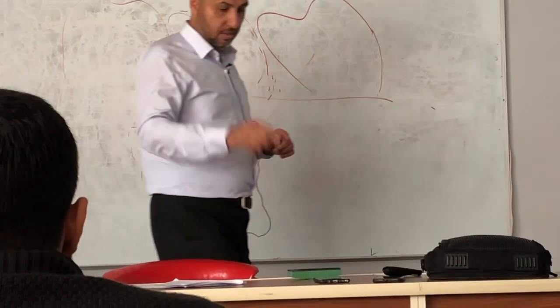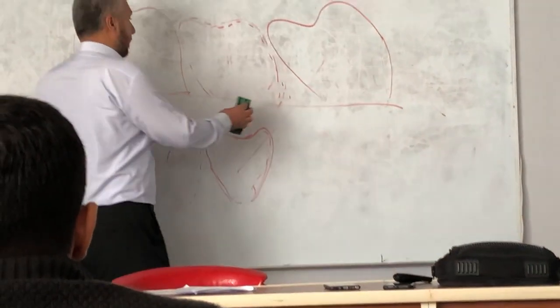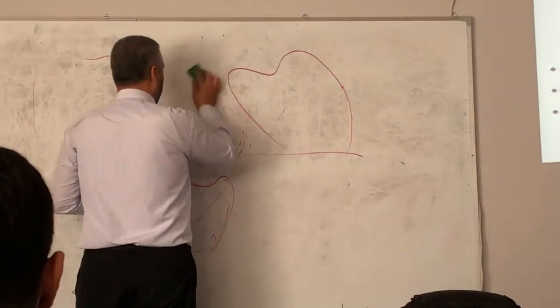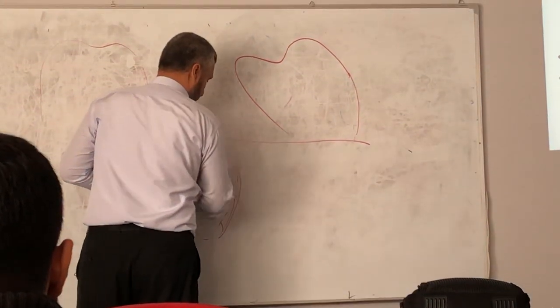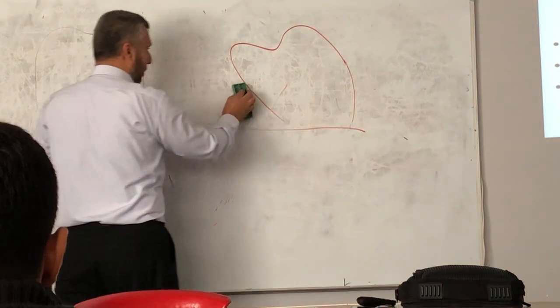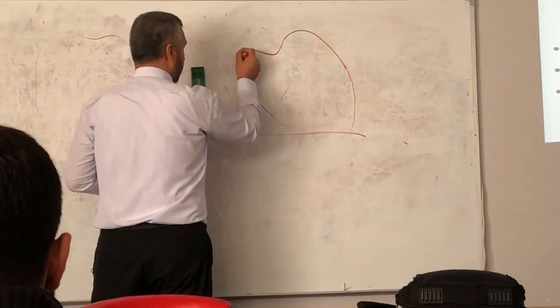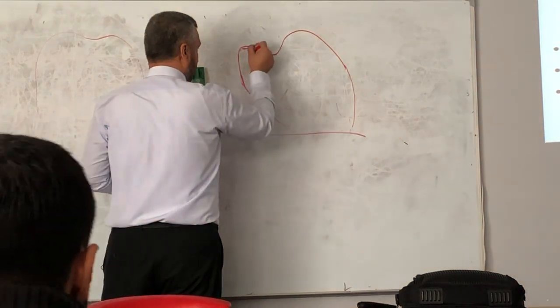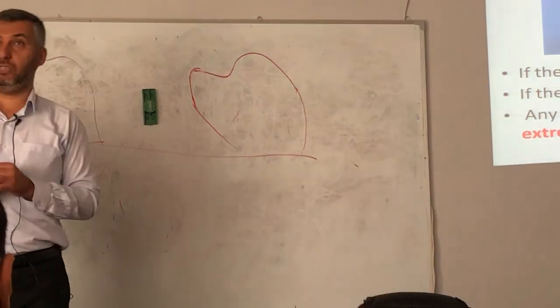But wait, we say we will do this tilting. This is one of the options. The other option is doing enameloplasty. In a previous lecture, we talked about enameloplasty. We cut as much of the enamel as possible, and we will do our arrangement.